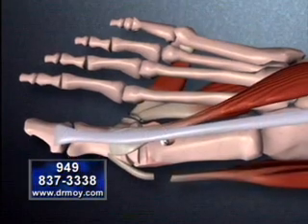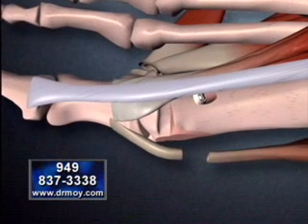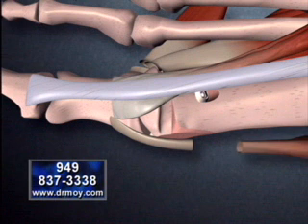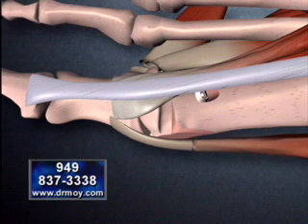A small segment of the tendon that was initially cut is removed, and the tendon is advanced forward. This will increase the mechanical function of that tendon in maintaining the great toe alignment.